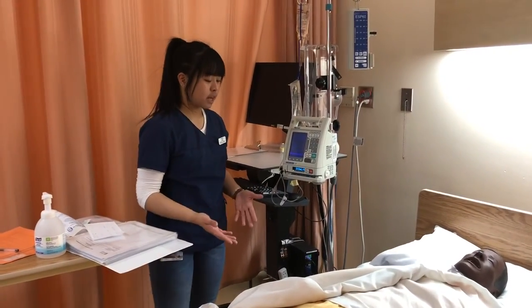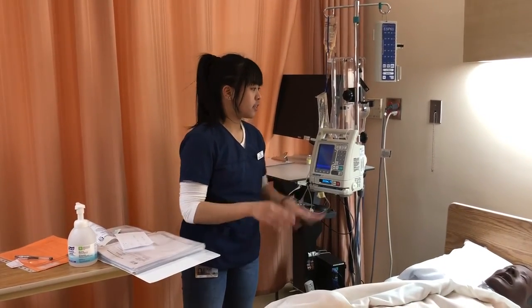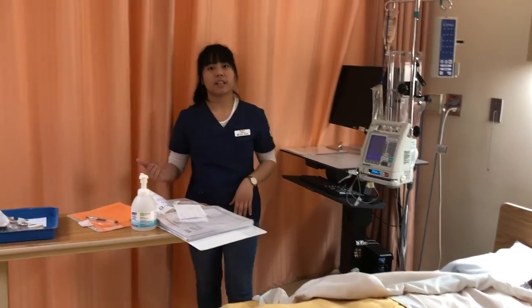If any of those side effects that we talked about, the nausea and vomiting, definitely let us know. And here's our call bell. And I will do my safety check. Patient's not under stress, it's the lowest position, no safety hazards. And then I'm ready to leave.